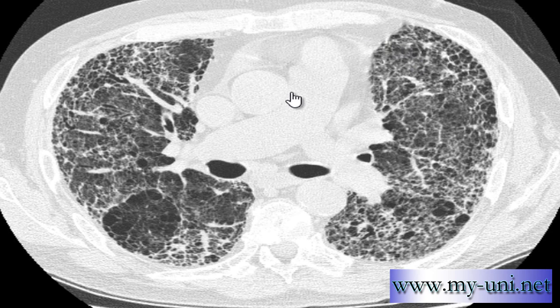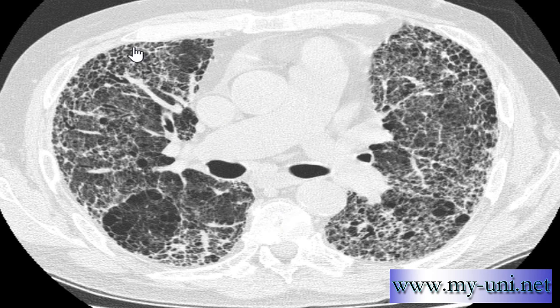One of the signs is septal thickening. This axial CT scan image shows severe parenchymal destruction with inter- and intralobular prominent septal thickening. An interlobular septal line should not be more than 0.5 millimeters in diameter. There are also cysts creating a honeycombing pattern, as well as ground-glass infiltrates.